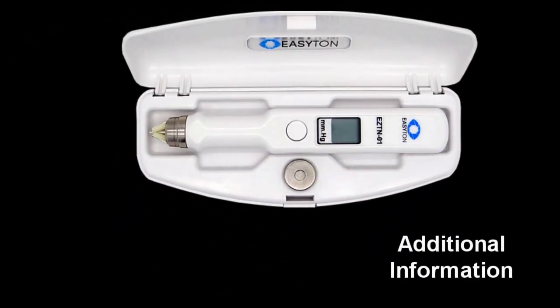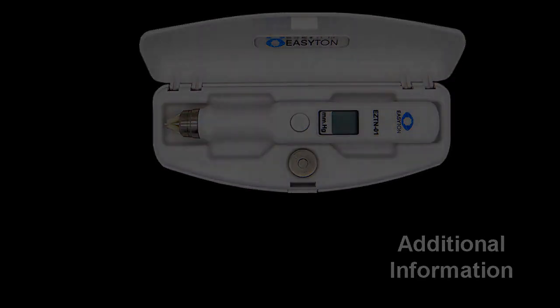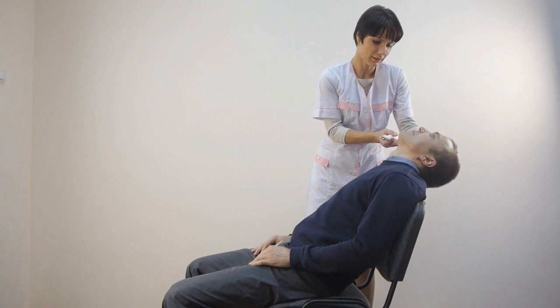Additional information: to obtain the most reliable results and to fully appreciate all the advantages of transpalpebral scleral tonometry, you only need to master the use of this tonometer. Please read the operating manual carefully. Use the tester to carry out a few test checks of the tonometer's operation and make sure to observe all the recommendations described in the manual. Avoid constrained movements when handling the tonometer. Practice the tonometry process on testing samples until you do it automatically. Your measurement results shall become accurate enough only after you learn to freely operate the tonometer and manage to obtain consistent test results.